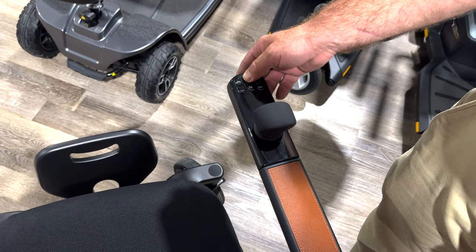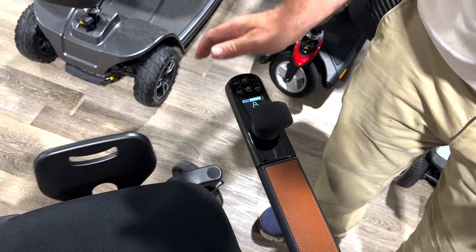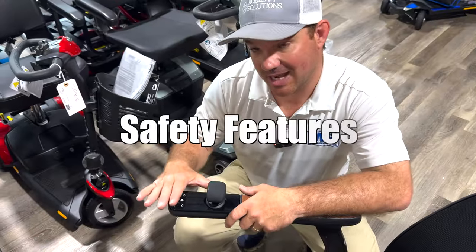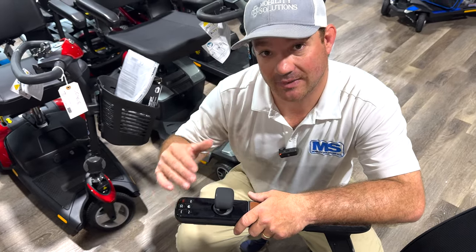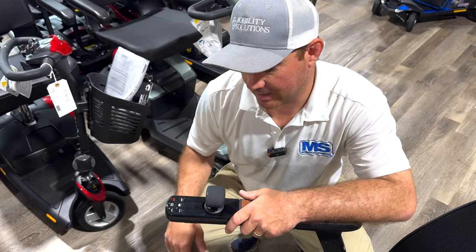So hold this for a second. So that's a security thing. So when you're getting out of this unit, you don't turn it on. But it's going to add a lot of security to it that you're going to have to teach them how to operate it at first. After that, it's not going to be hard.